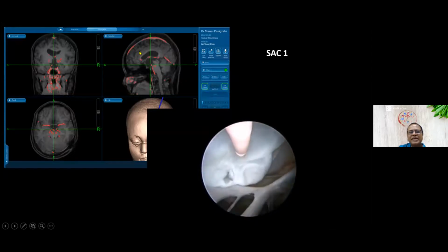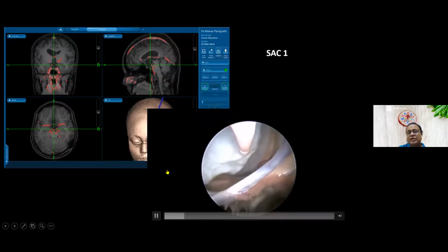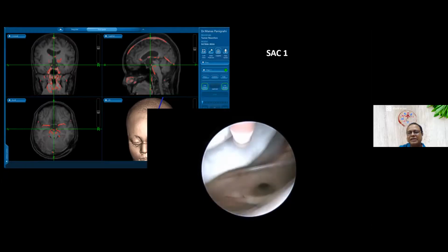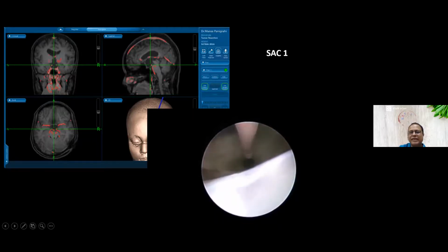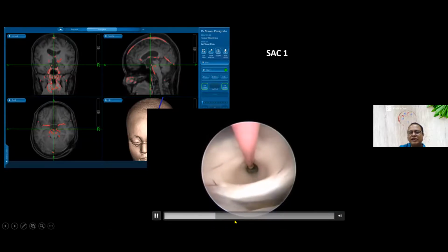But again, this patient had come with symptoms, so we had to do a surgery. It's a splitting of the diencephalic membrane. You can see here is a very thick membrane, difficult to puncture. So after puncturing the cyst, one has to dissect all around so that the aqueduct is free. Many times it's adherent. One has to free the aqueduct. Just checking that there is no aqueductal stenosis.